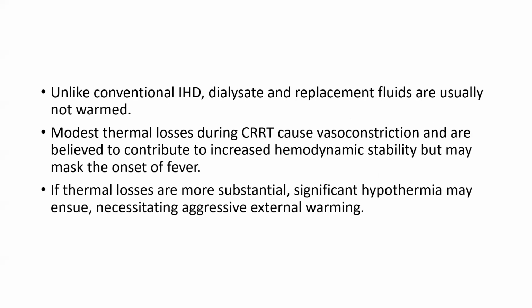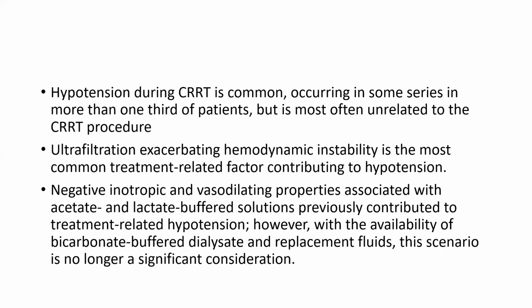Unlike conventional IHD, dialysate and replacement fluid are usually not warmed. Modest thermal loss during CRRT causes vasoconstriction and is believed to contribute to increased hemodynamic stability, but may mask the onset of fever. If thermal losses are more substantial, significant hypothermia may ensue, necessitating aggressive external warming.